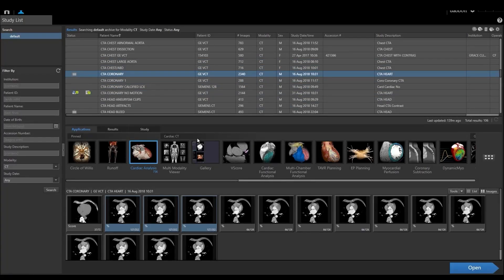Hello. This is going to be a demonstration of the cardiac analysis application using Vitrea.